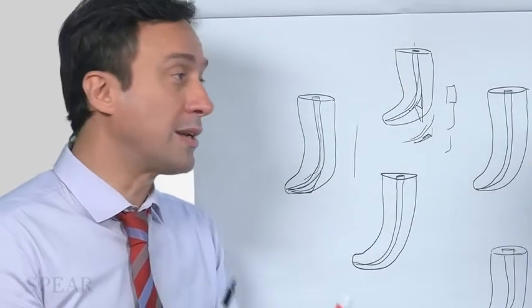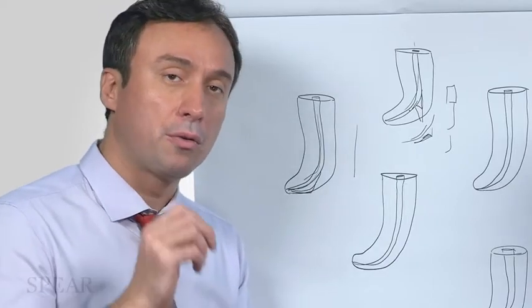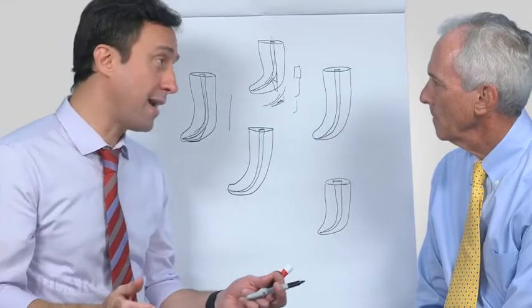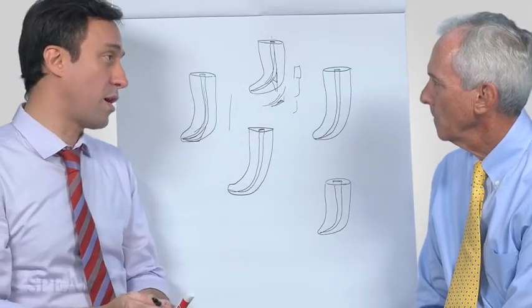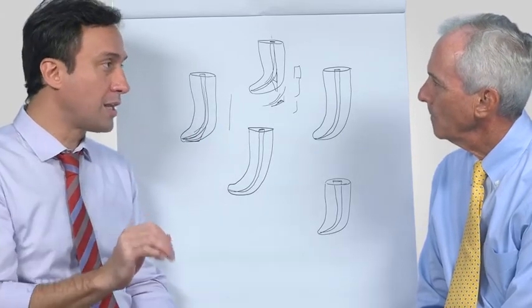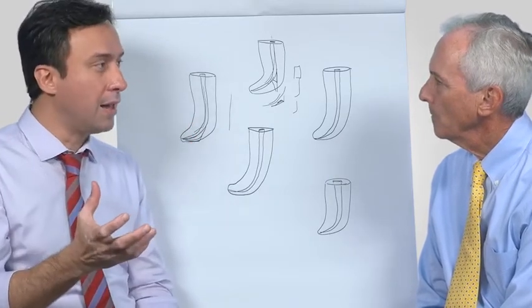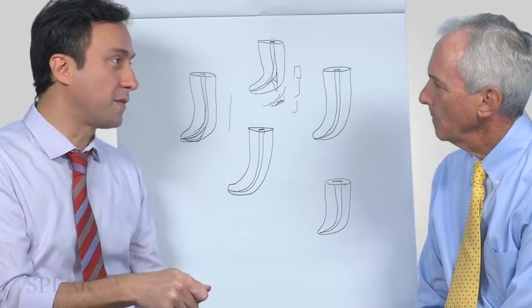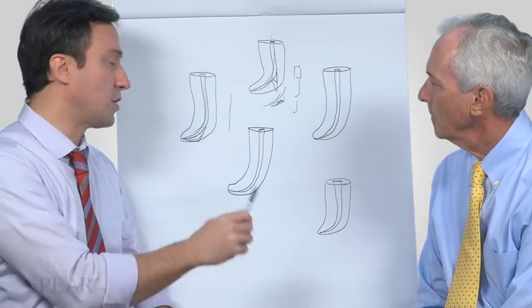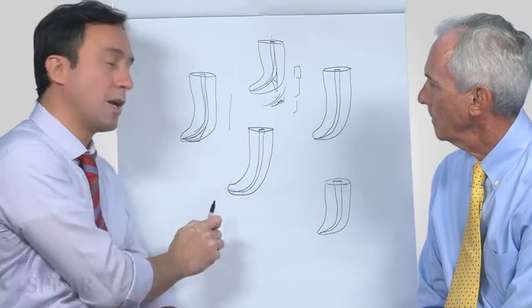You can't get around a ledge by force. A ledge or a block can only be gotten through by finesse and understanding the tactile feedback that you get. Endodontics, I found out, is the procedure that requires the least amount of force. In all aspects of it, it's just the lightest of touch. It's just about direction, about tactile feedback you get from a file. It's never about how can I get through this calcification, because it never requires that much force. It's just an understanding of what's causing calcification and what is causing the blockage, and then having files with finesse, with curvatures to get around.